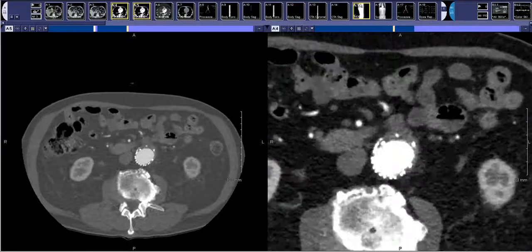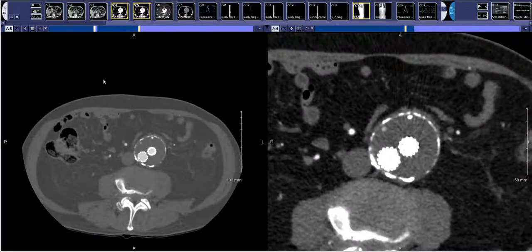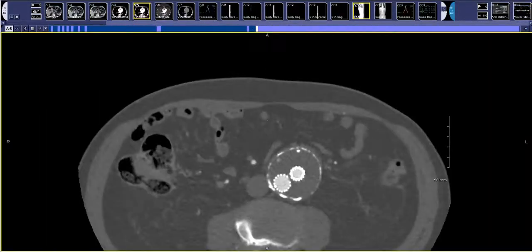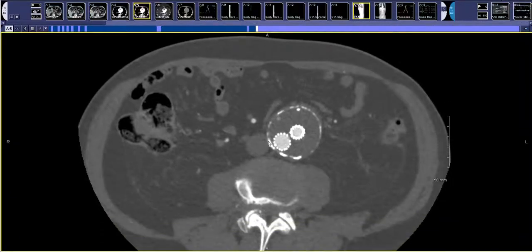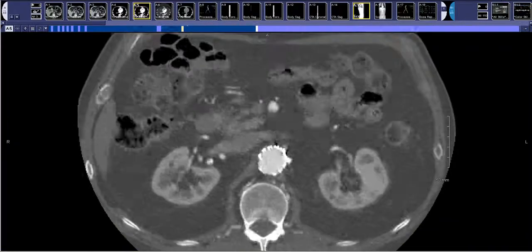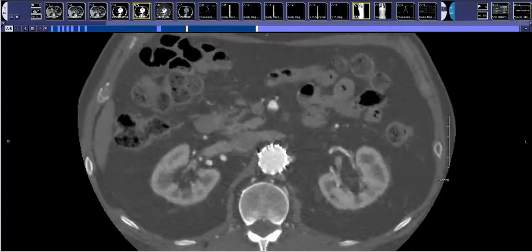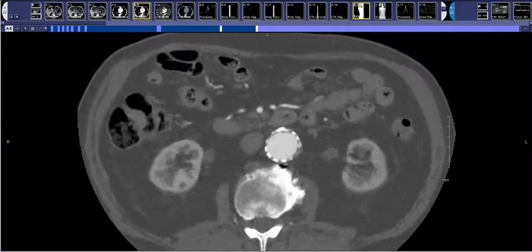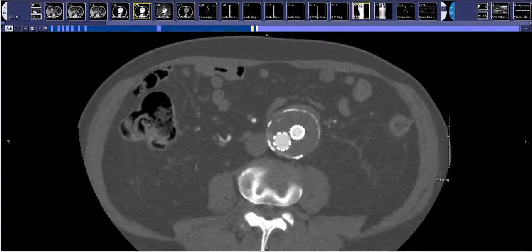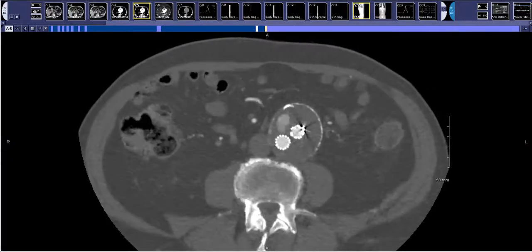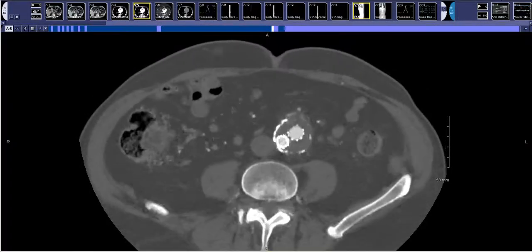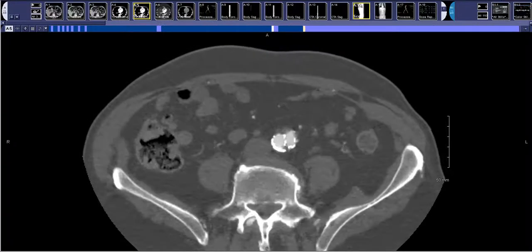This turned out to be a very good CT scan so it doesn't matter in this case, but occasionally you'll have very poor bolus timing — for example in cardiac heart failure patients. In those cases, if the aorta is not very bright, the lower energy dual energy images really make the contrast pop out.